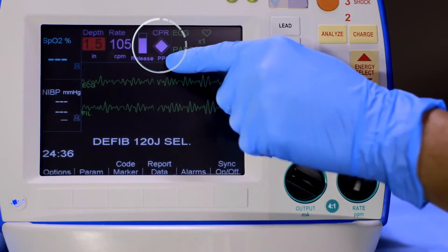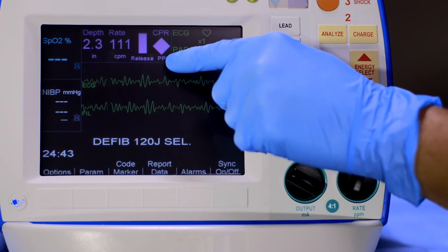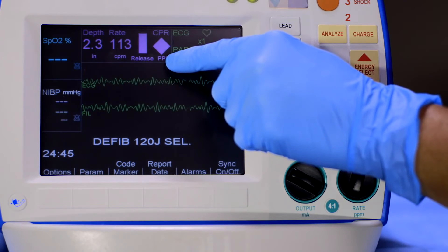The perfusion performance indicator integrates compression depth, rate, and interruption times into one visual indicator. Maintaining maximum value — a full indicator — provides visual indication of performance to the current guidelines.